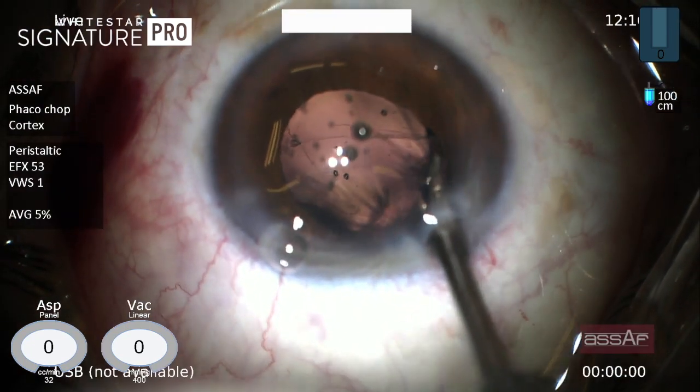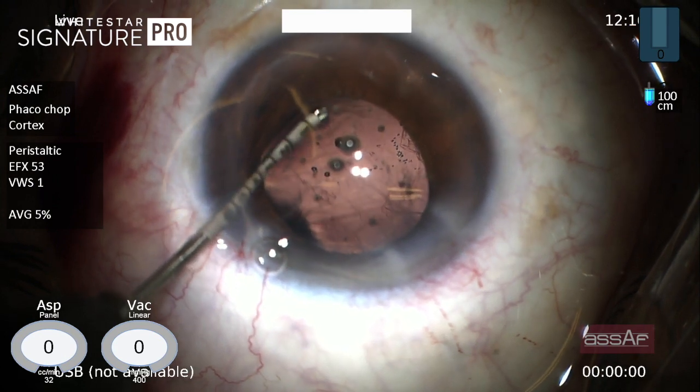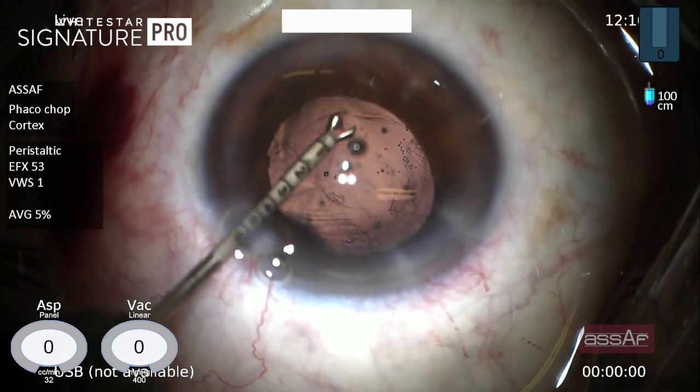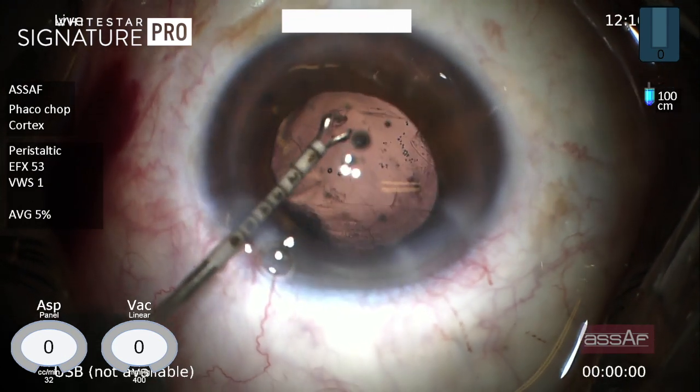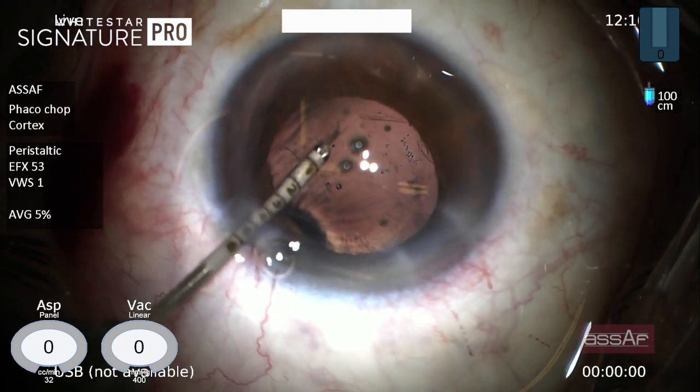Now I'm doing a small cut in the posterior capsule parallel to the edge of the pupillary border. I'm trying to convert this radial tear to a semi-circular posterior capsulotomy with the aid of the micro forceps.